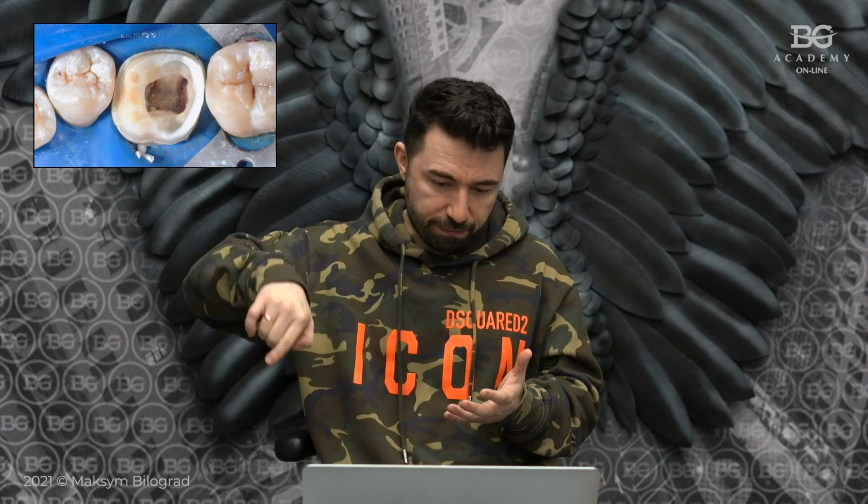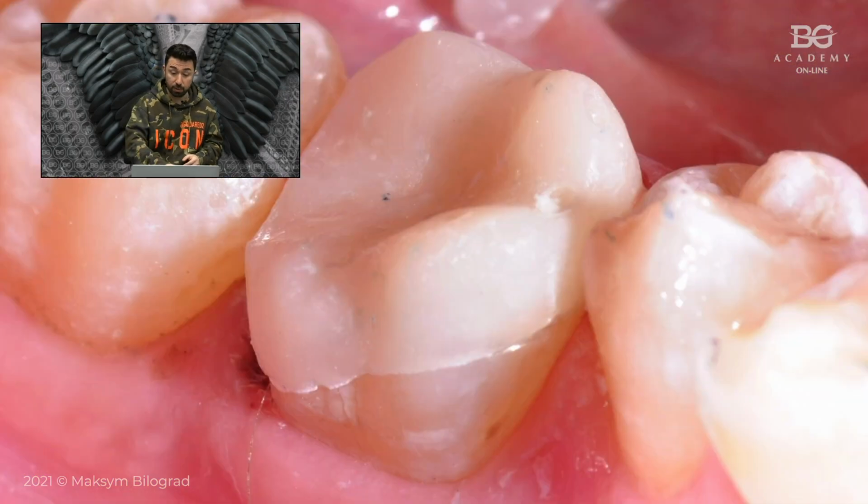And as you see, the tooth is already prepared for an overlay. So we just need to do a build-up to refine our margins, and then we're ready for provisional restoration. So that is after our preparation. Then we do provisional restoration, and then we can go for the next step.